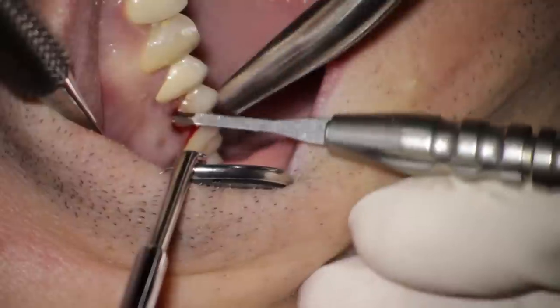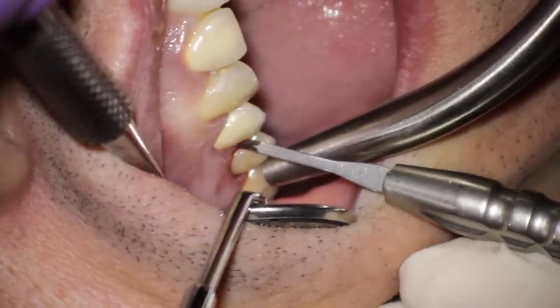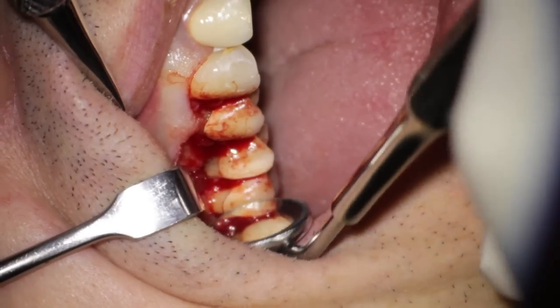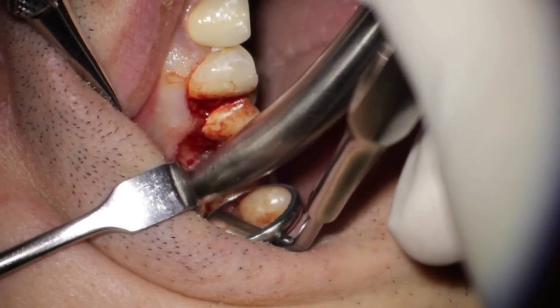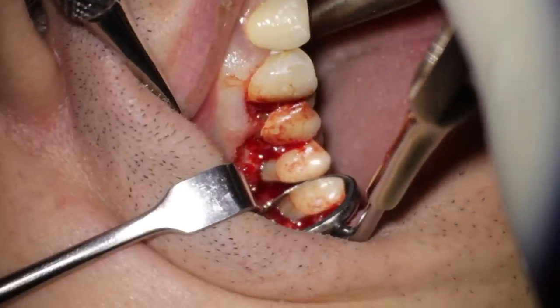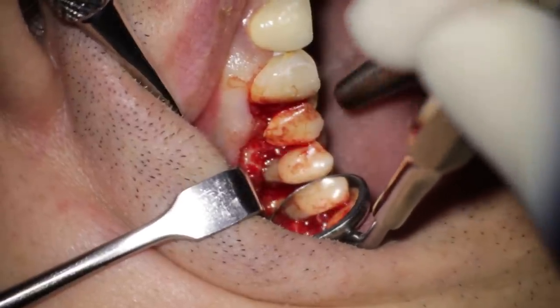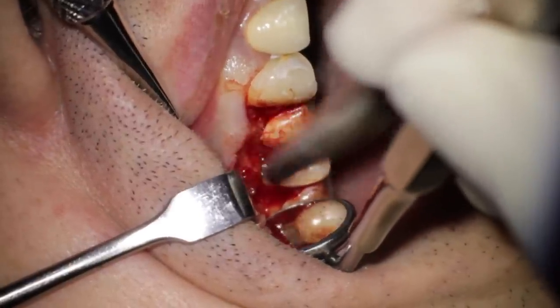The radiograph did not give us the information we needed, so we decided to make a small surgical cut to have a look at the root surface. There you can see a crack — the tooth had to be removed, of course.